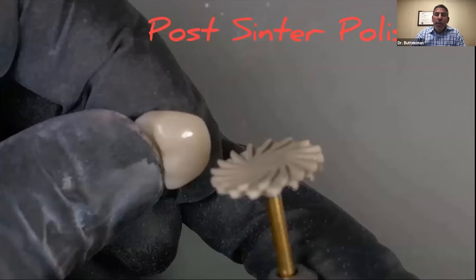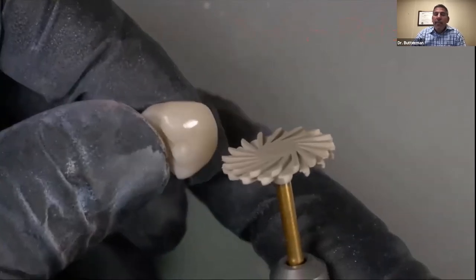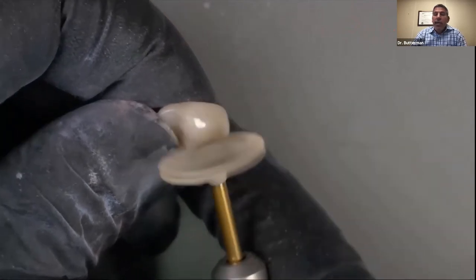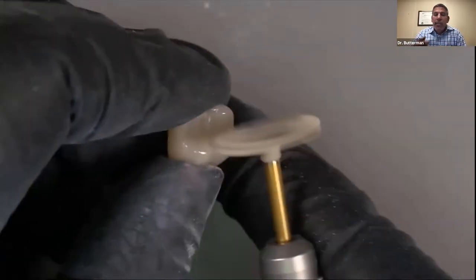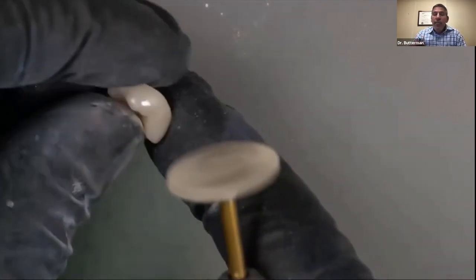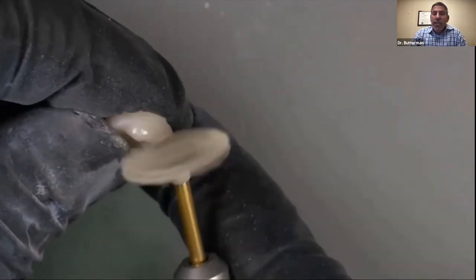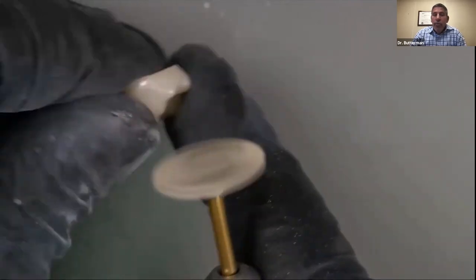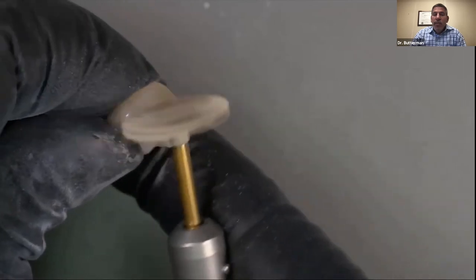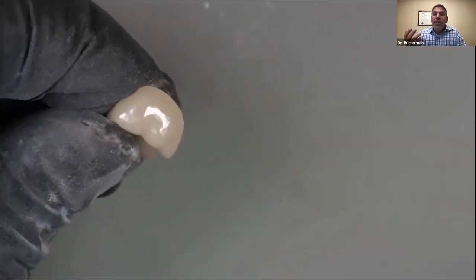At this point, the only thing that I need to do when it comes out is go over with that same last step and just give it that final wet look, that final gloss. Now, if you don't want to use a spiral polisher, you can certainly use something like a diashine paste, a diamond impregnated paste. I think Kuraray even makes a paste that works quite well for this. And all I'm doing, it's going to take me probably 30 seconds to do the final polish here. And you'll find that this is going to be very smooth.